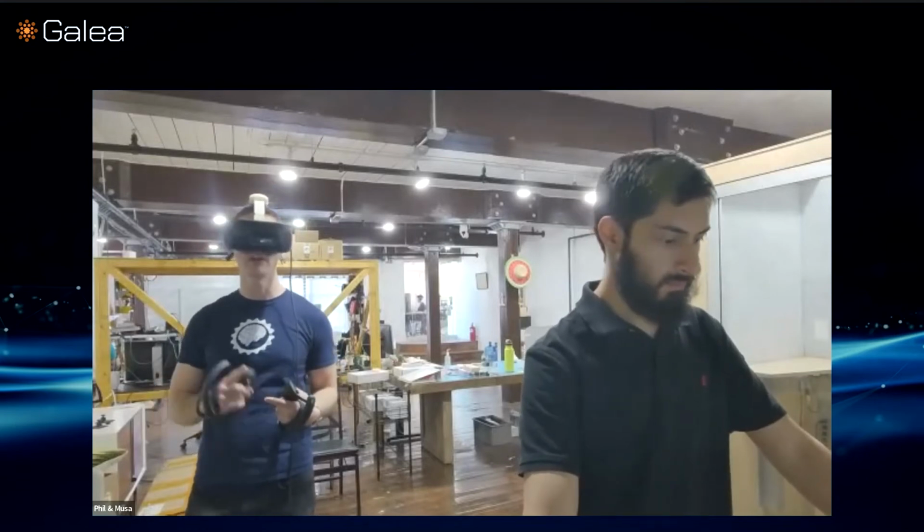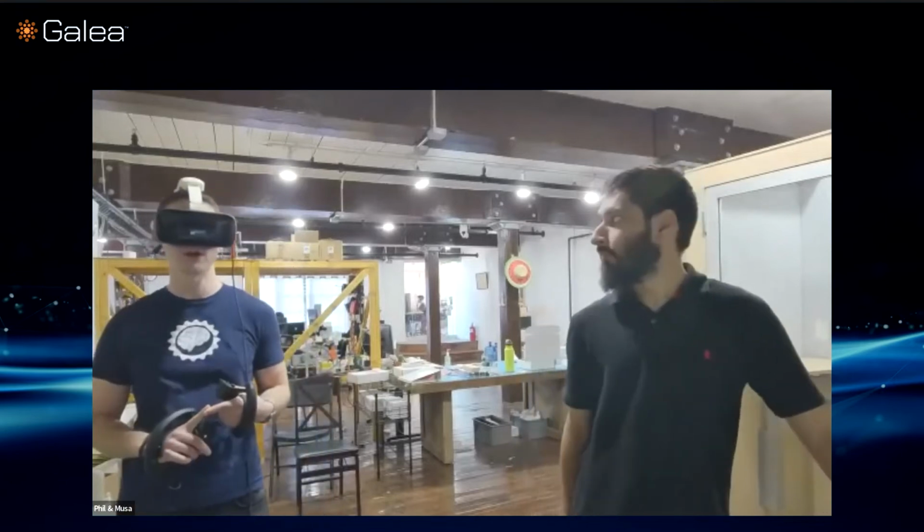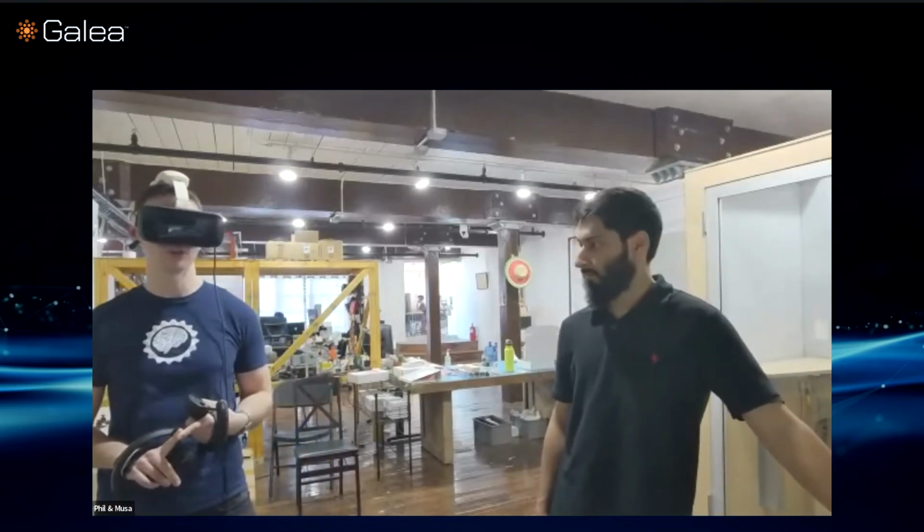So right now we use heart rate as opposed to heartbeat, but it's an interesting question because we've gotten this request from a number of different people. So it's something we'll look at in the future. This could look like a Unity action that fires off on every heartbeat or something along those lines. So it's certainly possible. It's not something we support right now, but definitely something that we could support.